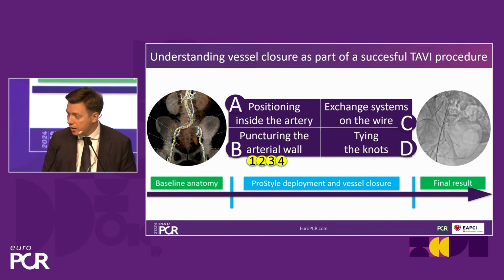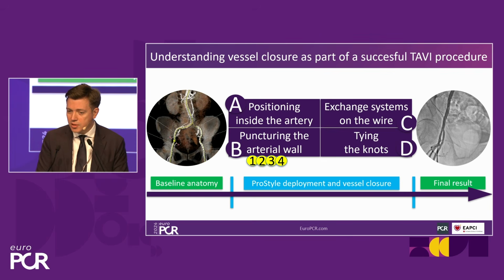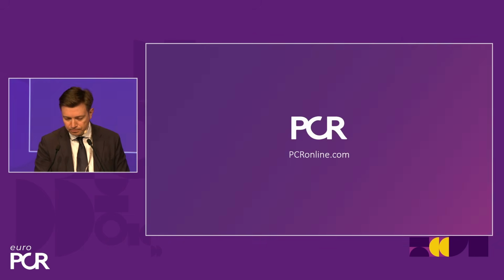We'll start with the baseline anatomy. So Oleg, can you tell us what is the best way to have a safe puncture so that our suture-mediated vessel closure will be successful?